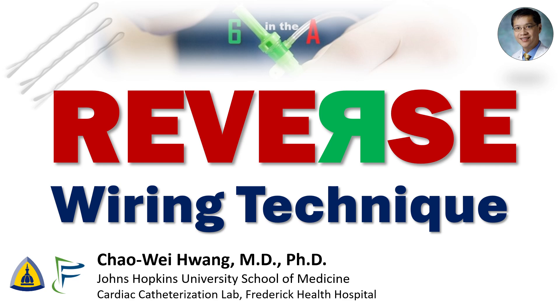Hi, I'm Chao Wei Huang from the Johns Hopkins University School of Medicine and Frederick Health Hospital. Today we're going to go over the reverse wiring technique, sometimes known as the hairpin technique. It's a useful technique to know for wiring extremely angulated side branches, especially when the origin of the side branch is just distal to a severe main branch stenosis.